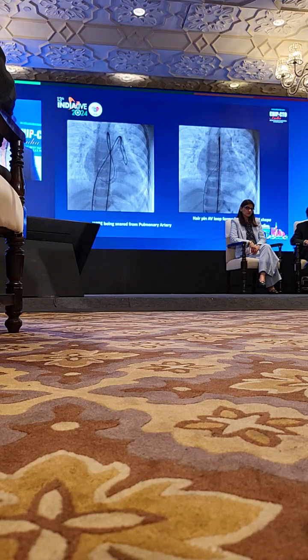So here I am snaring the terumo guide wire with a 6 French snare. So I've caught it and I've brought it down. Here we can notice one thing we have to see. There are so many steps in which we have to be careful. Here we can see that it's not formed a perfect hairpin loop. If it has not formed a perfect hairpin loop, it means that it would have caught some chordae as the wire was traversing through the RV. So it is an indication that there may be some difficulties.